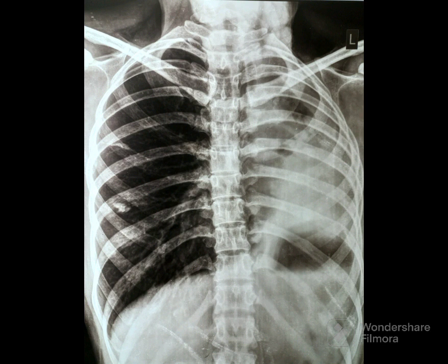Let us see one by one all the findings meticulously. First, the left diaphragm is elevated. Note carefully the left rib spaces — they are narrower than the right side.